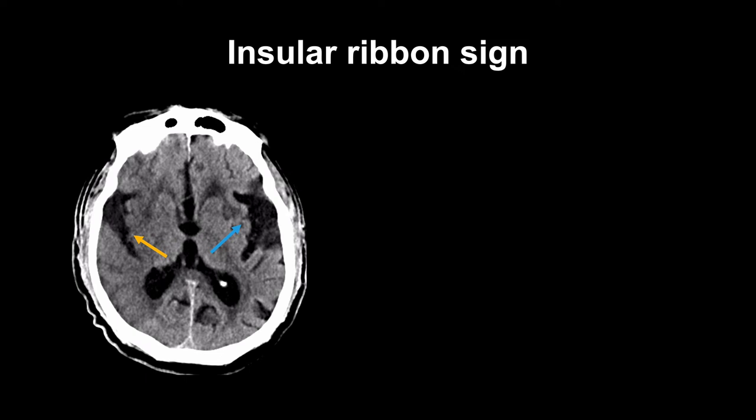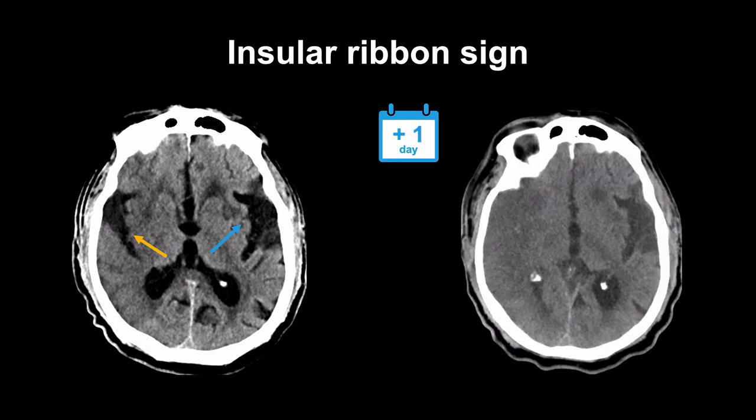Note the change in appearance in this patient's CT scan just one day later. That early insular ribbon sign was just a hint of what was to come, and this scan demonstrates the true size of the infarction. It should serve as a reminder that the detection of acute infarcts on CT depends on recognition of subtle changes in tissue attenuation.